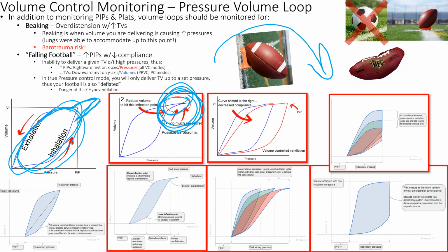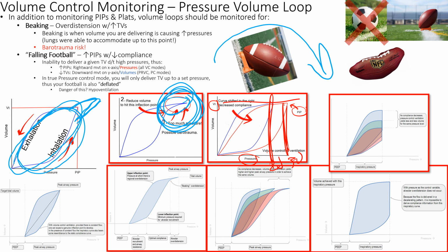It makes sense if you look at what this is measuring. It's measuring your tidal volume, and it's measuring your peak pressures. Here's pressure on this axis right here. So instead of being a pressure of 20, it's a pressure of 30. The volume is still the same because we're trying to get a good volume. And then you also see your volume, so this is my volume over here. My volume is going to start going down as my pressures start getting higher.